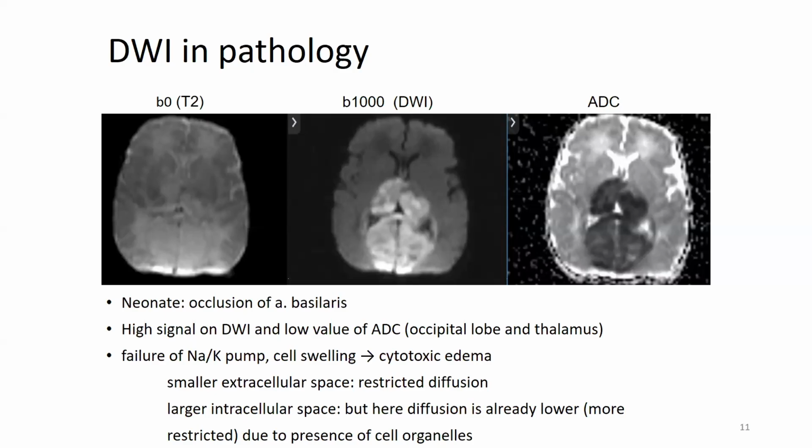There is of course still a little bit of water, but these water molecules can hardly move anymore. They actually become kind of static molecules, as if they are fixed in this cage and they cannot move around anymore. So the water remains in this smaller extracellular space, and we have what we call restricted diffusion here.